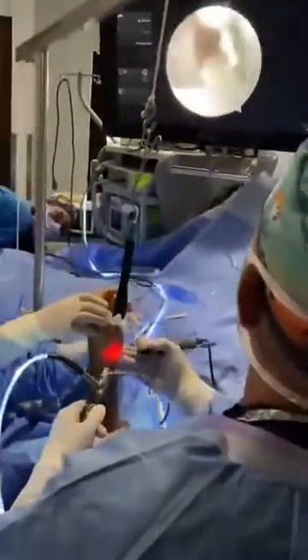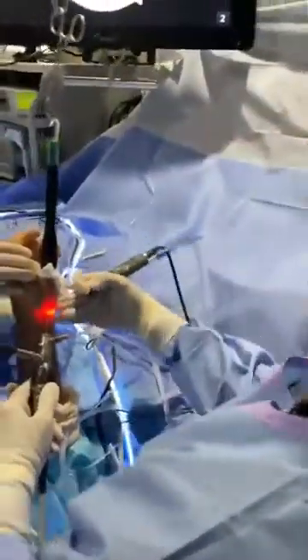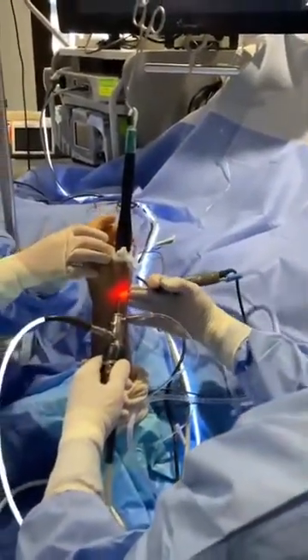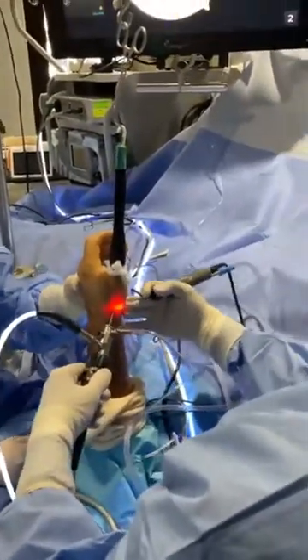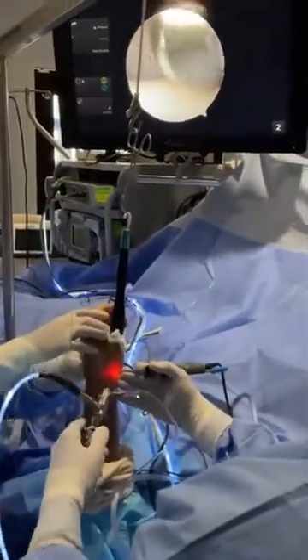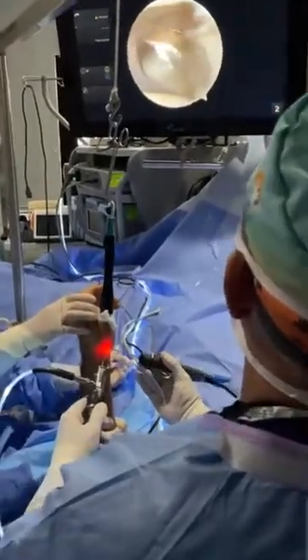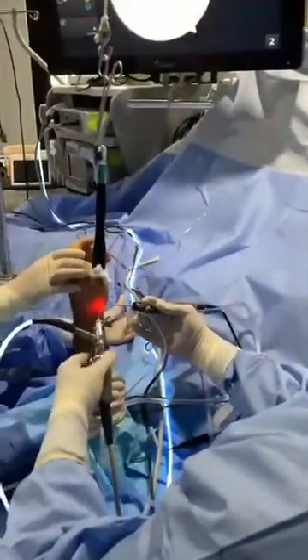If you could explain what's going on in each portal with the tools that you're holding. Well, this portal has a camera — it's a 1.9mm camera, so it's not something you're going to hear about much. Only a handful of my colleagues really do a lot with that small camera. I think there's a lot of potential. I've been doing it for 25 years, so it's not new, but for whatever reason it's still not a commonly done procedure.